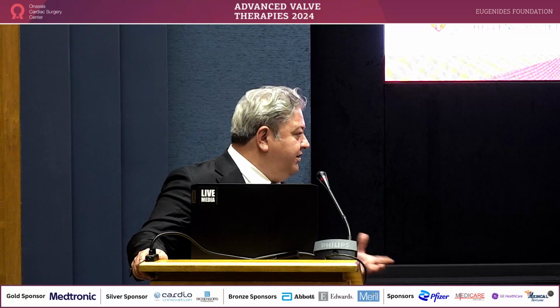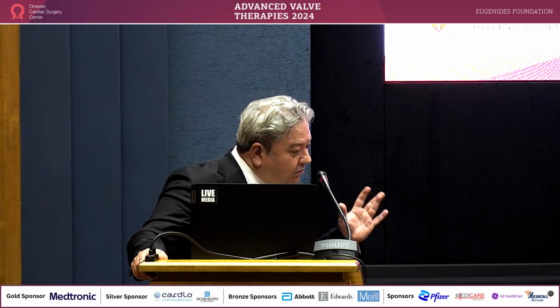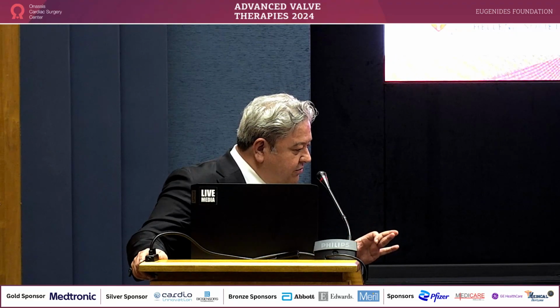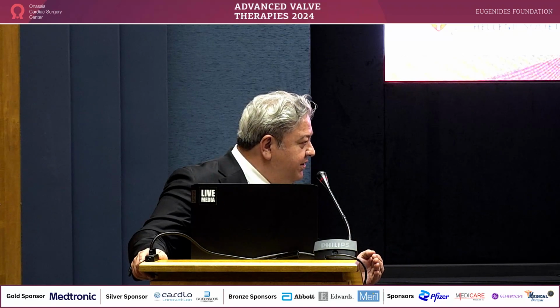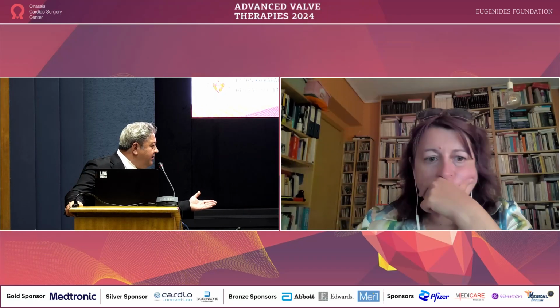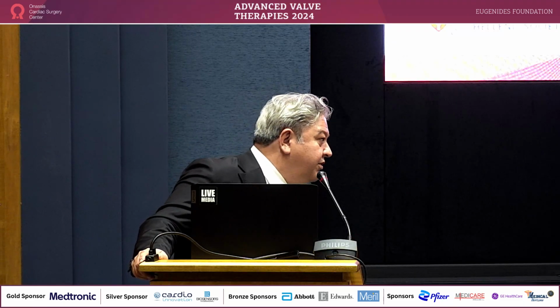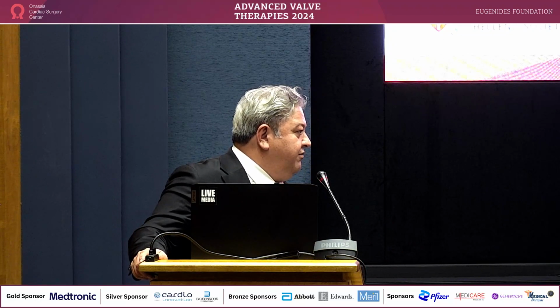Heart failure is really problematic for this patient. When heart failure symptoms are prominent, when we look at the transthoracic image, we see paravalvular leaks, but it is, for example, grade 1, 2. It is very important to do transesophageal echocardiography for these patients, because TEE shows the exact value of the paravalvular leak.